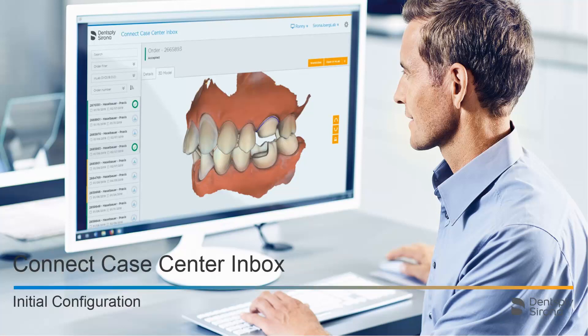Welcome to this video tutorial on the topic of ConnectCase Center Inbox. In this tutorial, we demonstrate the initial configuration of the inbox after installation.